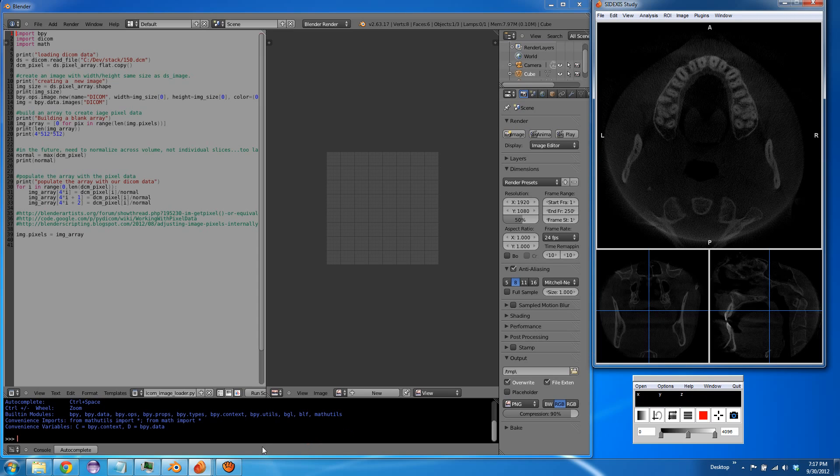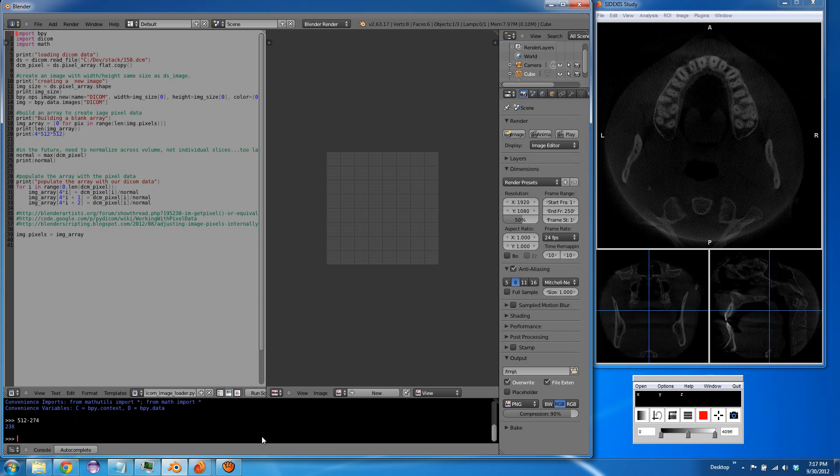So that's the slice we want, 274 to 276, something like that. I think it reads from the top down, so 238 will be the slice that we want.